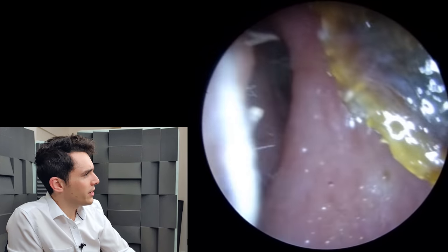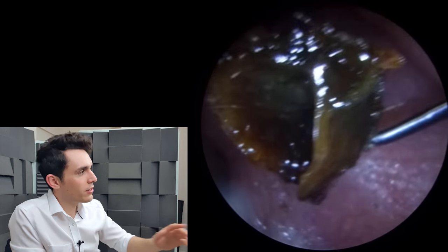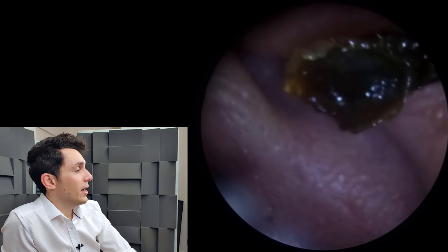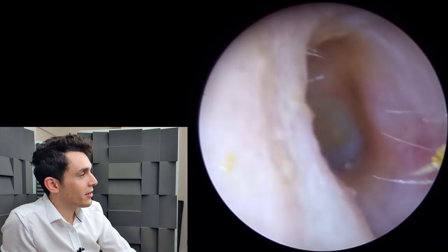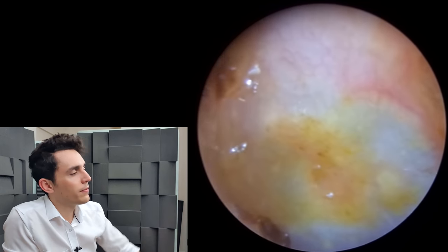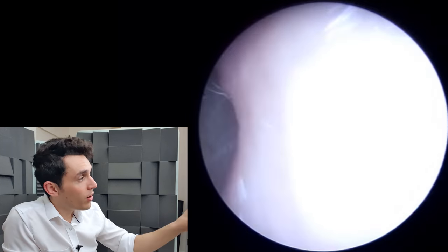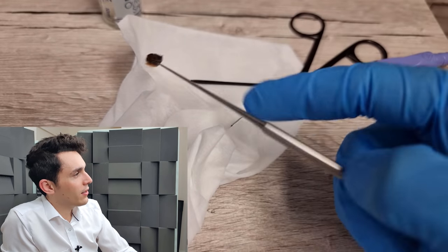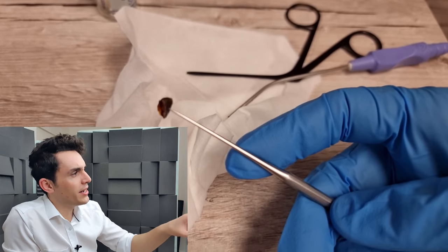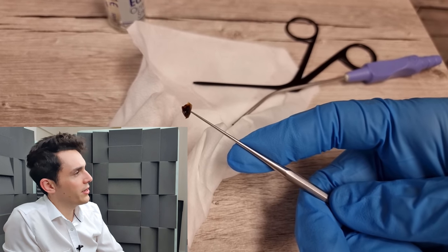We'll take a look at it with the endoscope. And you can see — just right there — see how it's kind of like a cave? That's why it was so difficult and so resistant to the suction. There's the eardrum, and as you can see, the eardrum is stained yellow. So the back end of the plug was obviously in contact with the drum, but otherwise everything looks good. Here's the plug — it's about a centimeter in size — stuck on the end of the Cawthorn hook.